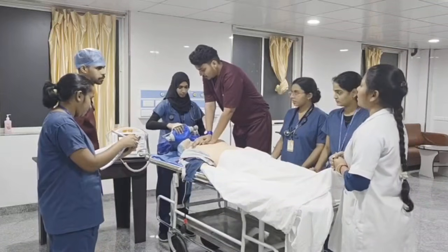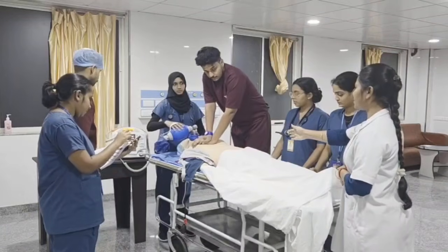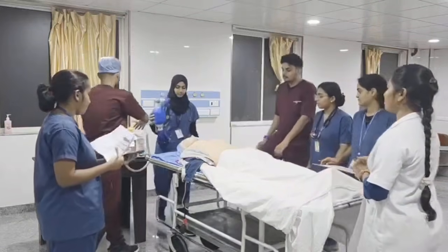Shock is charged. Pause compressions so that we can deliver the shock. Everybody clear? All clear.